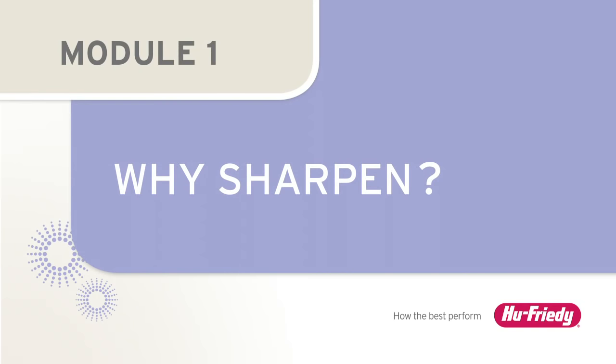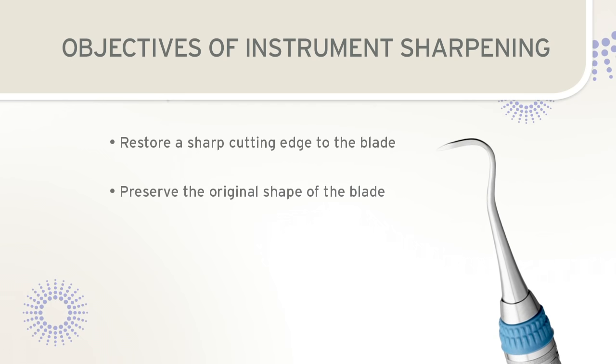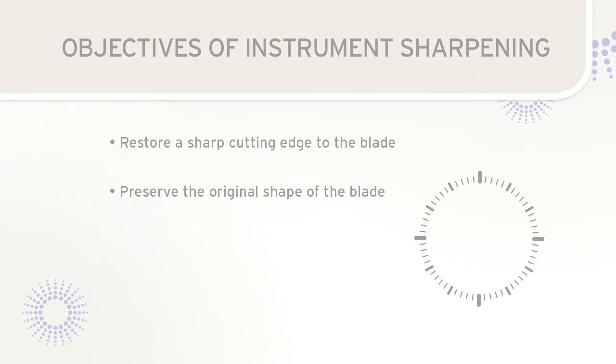Why sharpen scalers and curettes? The objective of instrument sharpening is to restore a sharp cutting edge to the instrument blade while preserving the original shape of the blade. This presentation teaches a technique that uses the face of the clock as a guide for proper alignment of the instrument and sharpening stone. With practice, this technique will allow the clinician to consistently produce sharp edges on scalers and curettes.